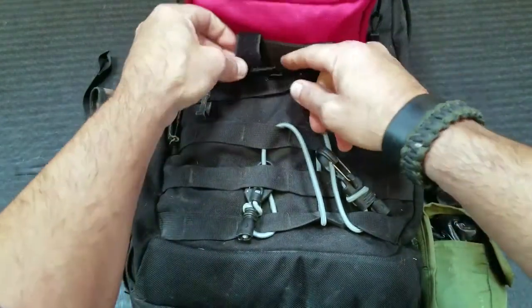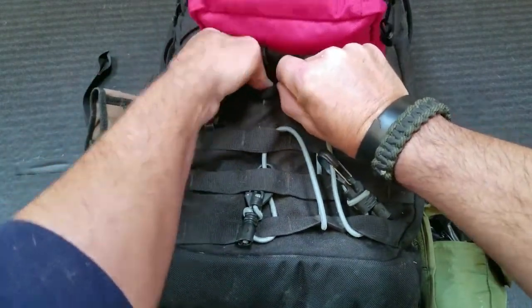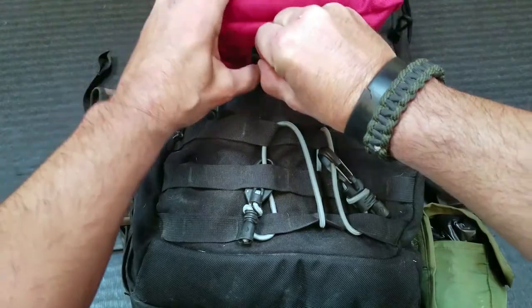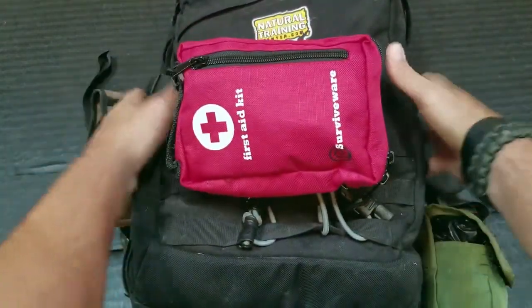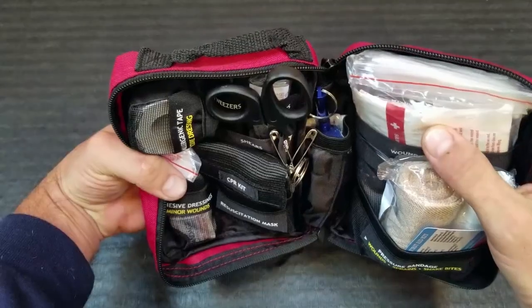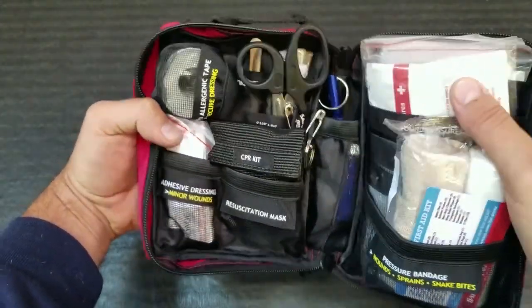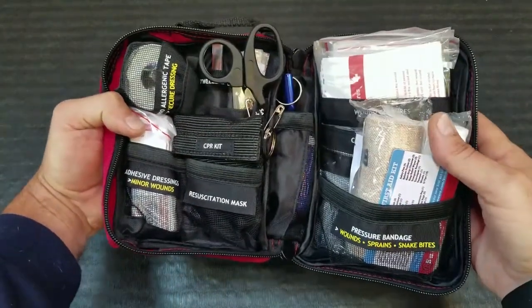Now, speaking of outside, this bag itself is not waterproof — it is water resistant. But as we go ahead and open up this bag, all of the components inside are basically sealed, reusable, watertight bags. So you're still pretty good to go, even if water gets in here — your first aid components will still stay dry.